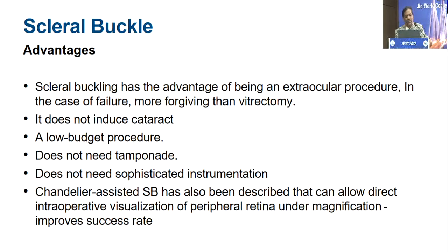It does not induce cataract. It's low budget. Doesn't need many times a tamponade. It doesn't need sophisticated instrumentation. And if you have a chandelier-assisted buckle, it is very easy to do without really bending your back.